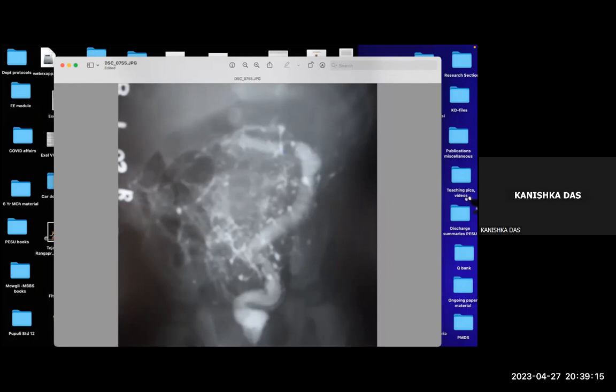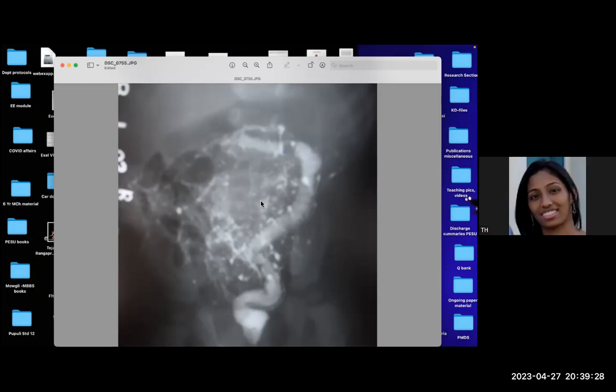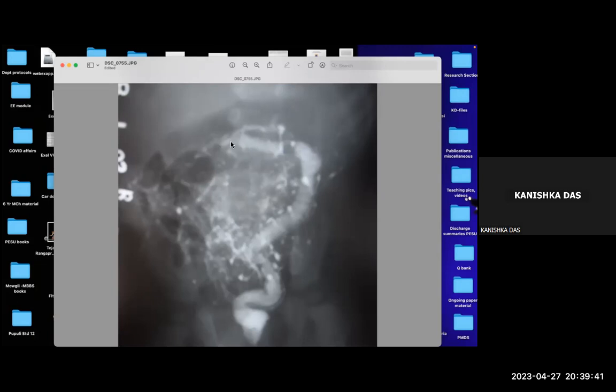And there is, I'm not sure, a calcification or a reticular pattern. What is all this in the background? What does it look like to you? You can see here some dilated bowel. Till here it's narrow and then some dilatation. Yes, but since it's not filled well, you can't comment on that. Probably there is something here, but we don't know. I wish it had filled.